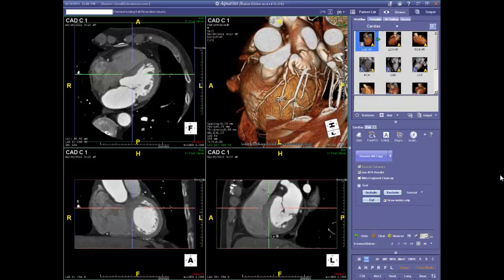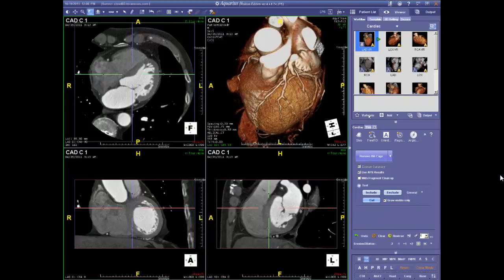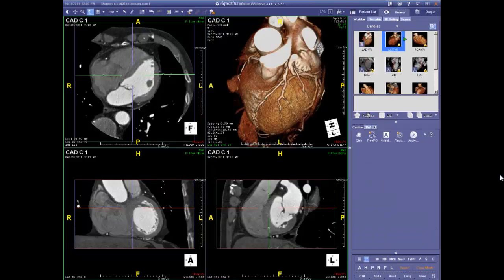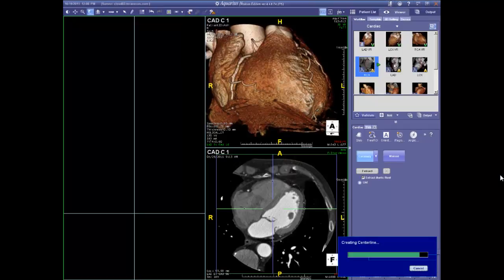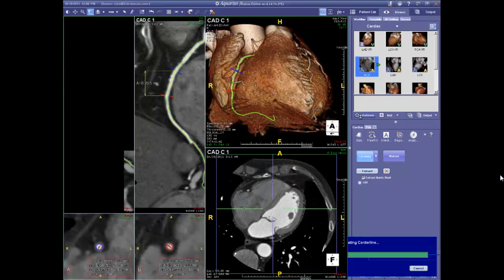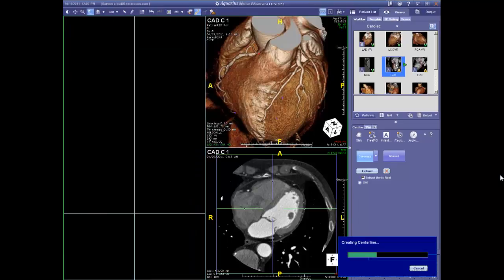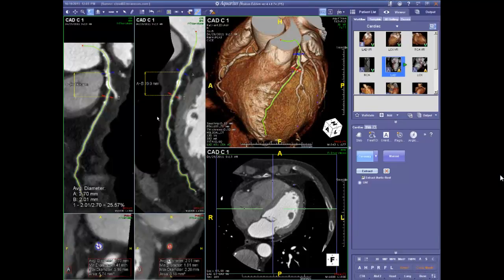Marianne comments: Dr. Carter-Newton was actually doing a lot of validation from the upper right-hand corner, which is called a workflow template. These workflow templates can be customized to your specific use at your institution. The reason he was validating those is that these can actually be saved as a works-in-progress scene, so that when you open the case back up, you open the scene and are able to edit what has been done without losing any of the work.